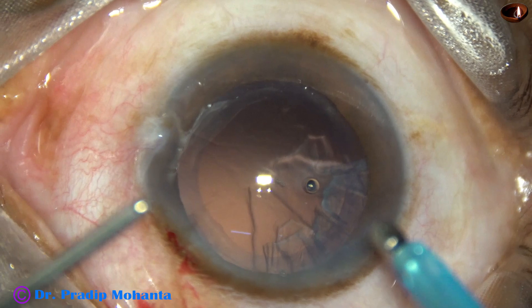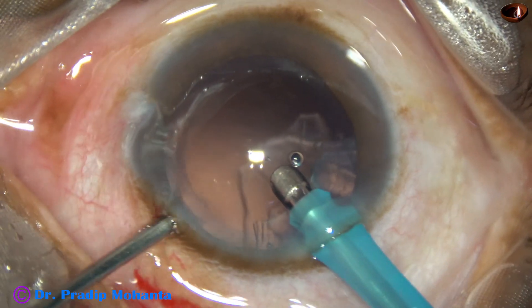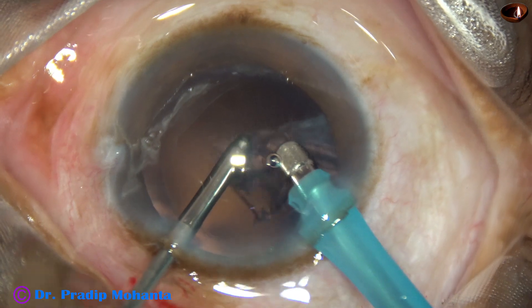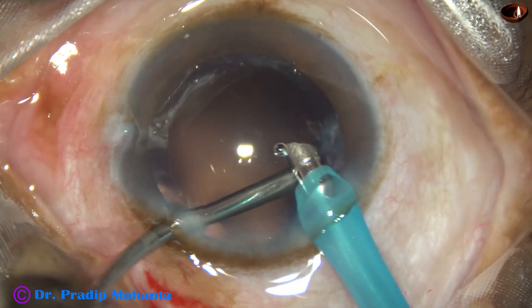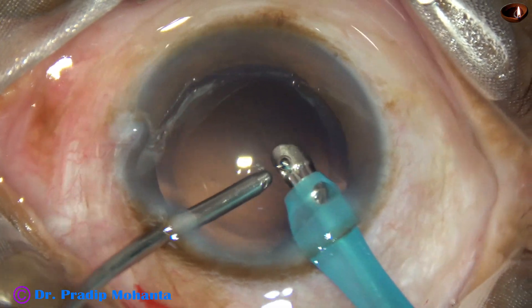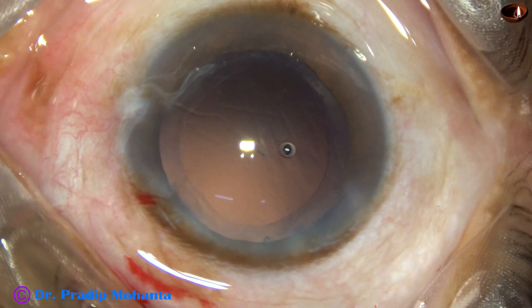This is the Oertli EC tip. We are using irrigation from the handpiece and aspiration through another cannula. So this is Hybrid IA — we are using the main wound for irrigation and an aspirating cannula is used to aspirate the cortex, the sub-main incision cortex.